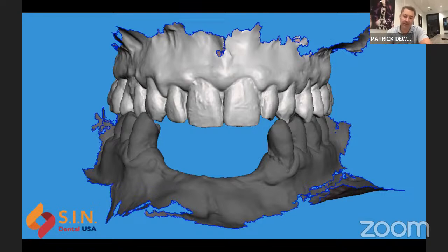On the post-operative scan, after all the teeth are gone, there's a lot of blood, a lot of saliva, and a lot of alveoloplasty, meaning the bone's been reduced. Especially in the mandibular jaw, there's a lot of mobility with the tissue. Therefore, it limits the available intraoral scanners that will actually work effectively to only a few.